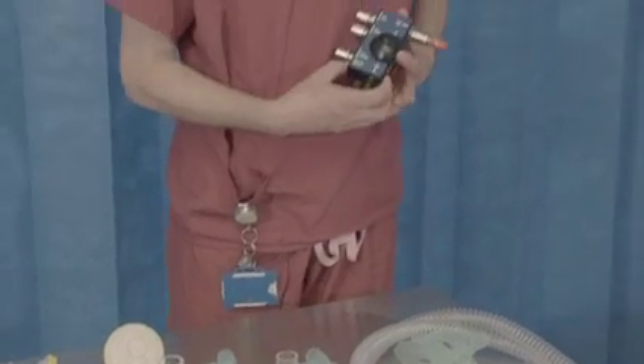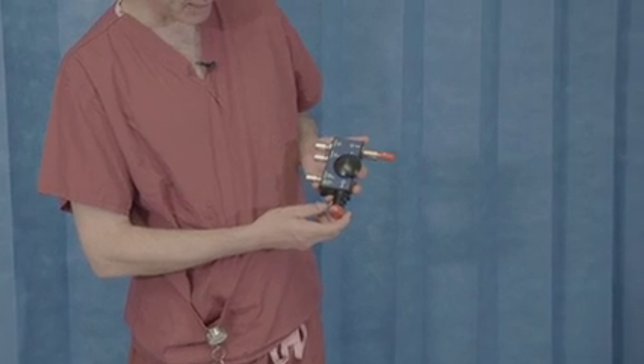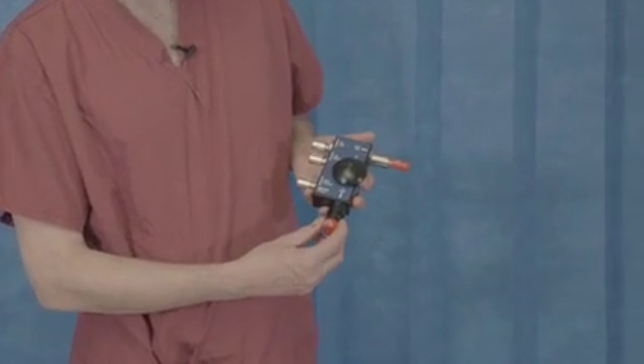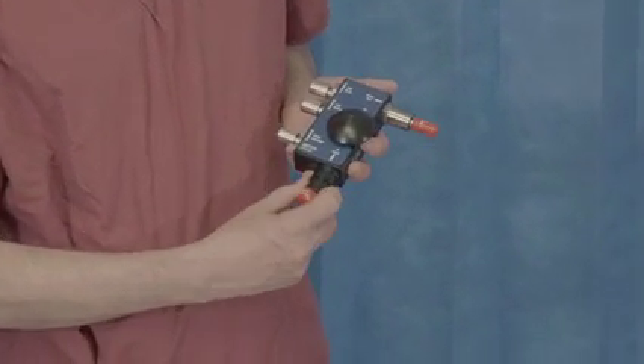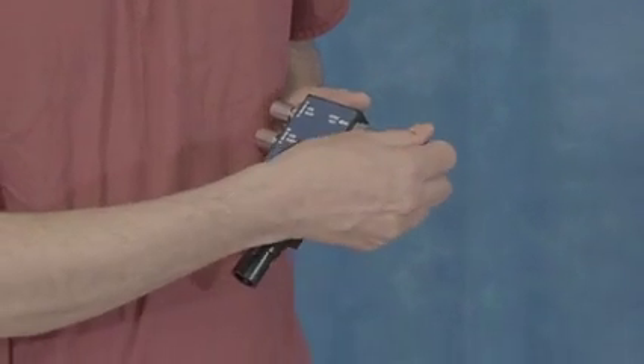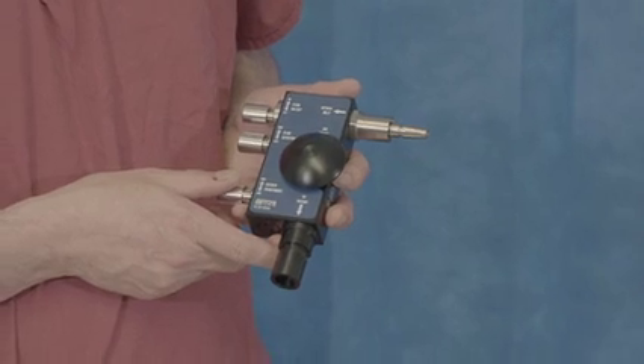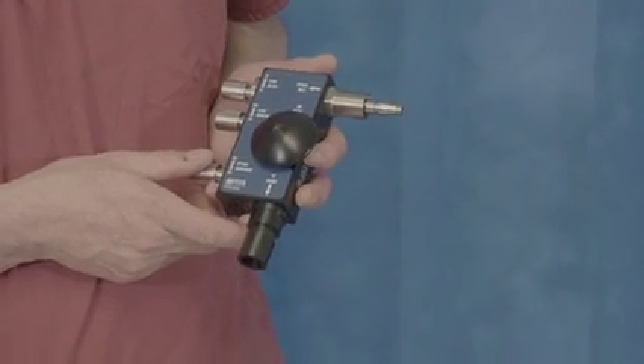So let's start with the flow generator. It comes in a box packaged similar to this. Importantly, we need to remove the two red caps — they do say 'remove before use.' With that, we can then assemble our circuit, and there are a number of components to this.